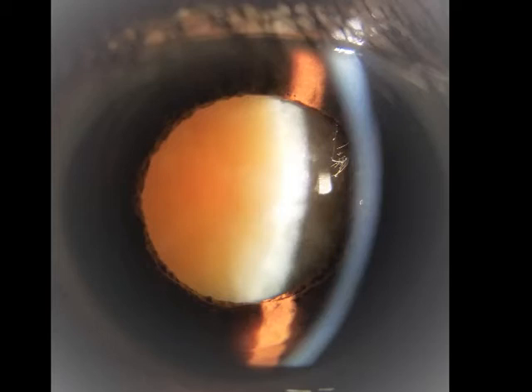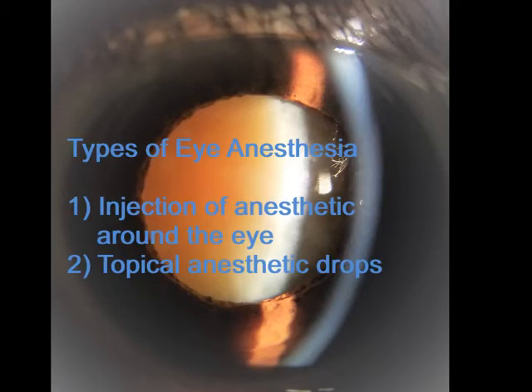At the surgery center or hospital, an IV will be placed to give you some mild sedation to help you relax. The ocular anesthesia is done either by injecting lidocaine, a numbing medication, around the eye, or by using topical anesthetic drops. Patients are generally comfortable throughout the short procedure. If we use the anesthetic injections, we will put you to sleep for a few minutes so that you do not feel or remember this part.